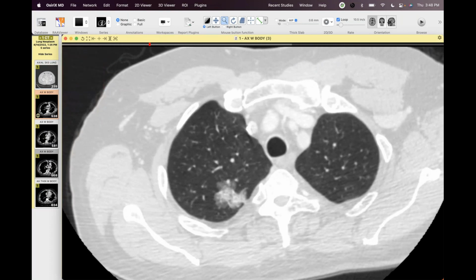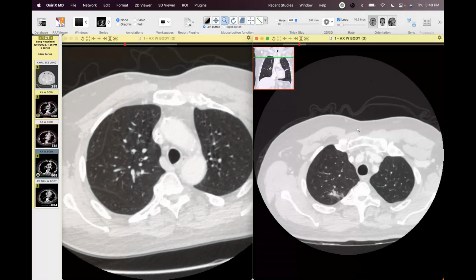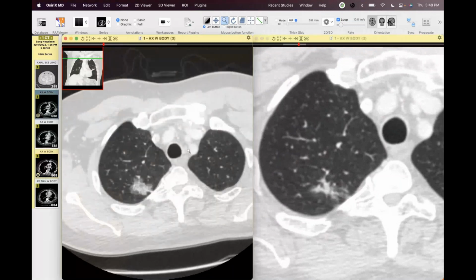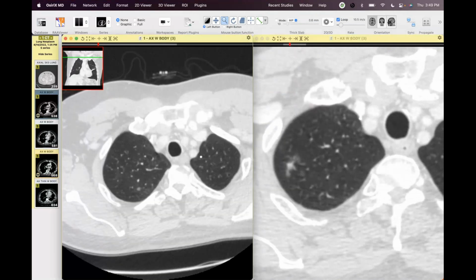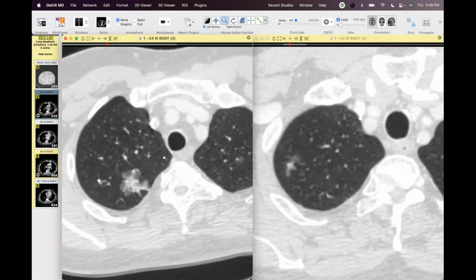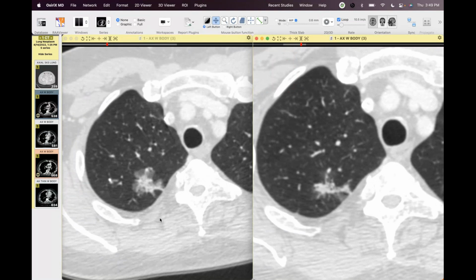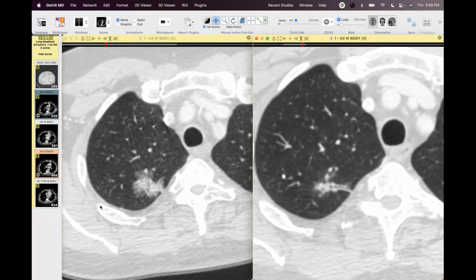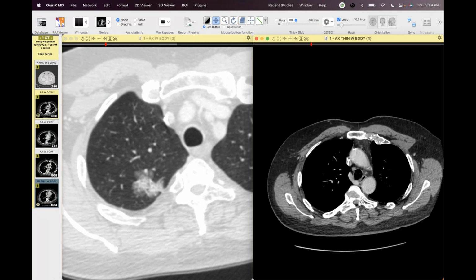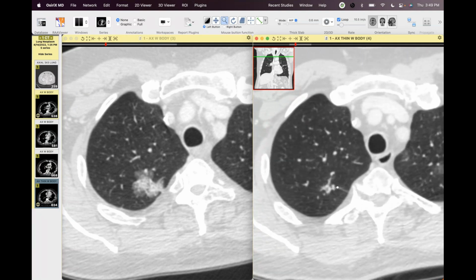And then a couple studies later, you can see this lesion has shrunk basically. And same with this one. We think of these, whatever you want to call it, multifocal adenocarcinoma or synchronous primaries, but I don't generally think about these being sensitive to therapy. It clearly looks like it responded to whatever therapy they were given, because even on the more recent one, these had decreased as well.